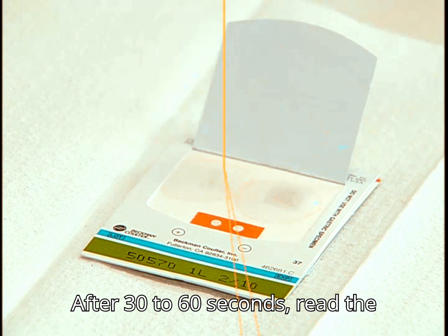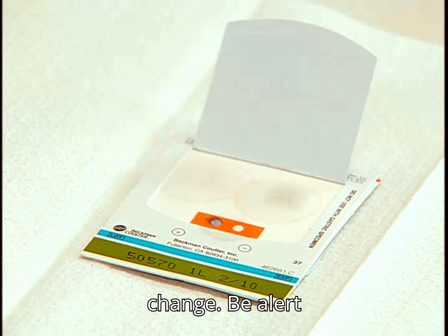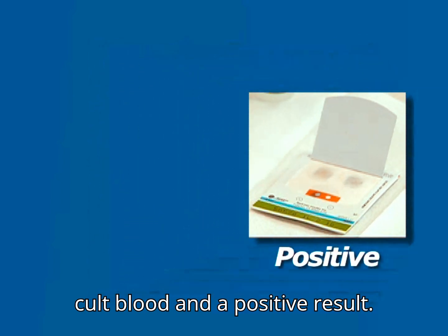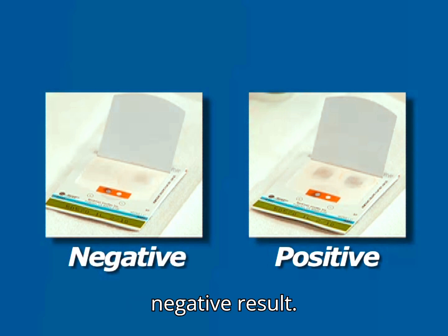After 30 to 60 seconds, read the results of the test, noting any color change. Be alert for a bluish color, which indicates occult blood and a positive result. A lack of color change indicates a negative result.